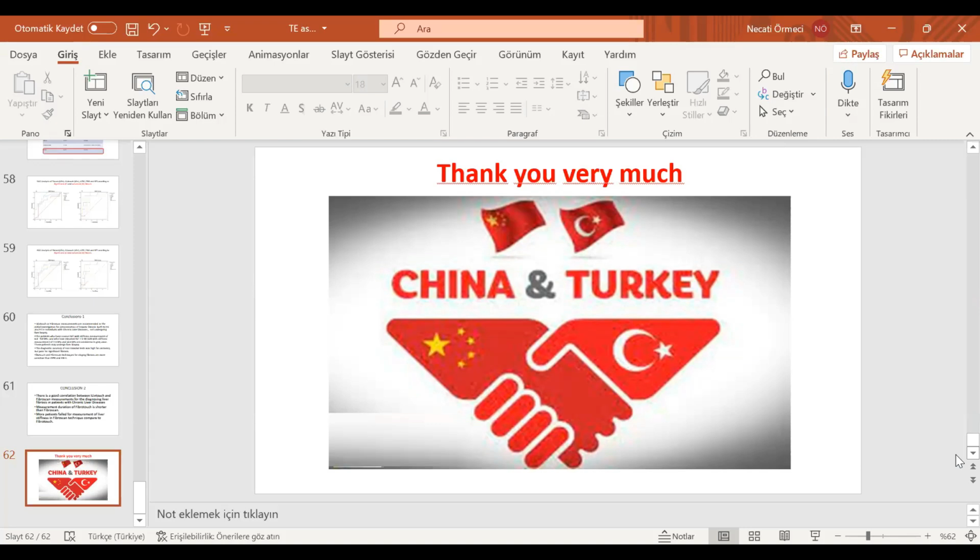But the other study showed that the chance of having large varices is more than 27.5. These are not big differences, 27 or 25; these are small differences. So if we remember the round number, which is 25 kilopascal, then if the platelet count is less than 110,000 or less than 100,000, we should offer screening for varices in these patients.